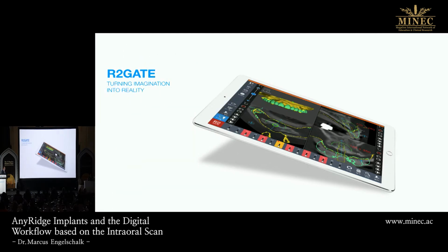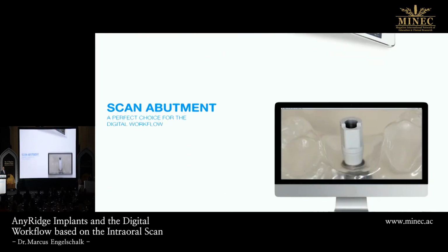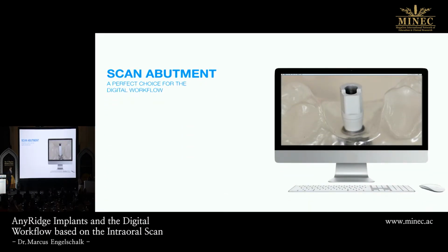So, R2 gate is the thing I don't want to talk about too much today, because we already heard a lot of it. This means we are planning right from the beginning. And trust me, it's not only for the full edentulous case. It's nice to have an R2 gate for 1 implant or 2 implants. It's easy to do. It reduces your time of surgery. But coming back to the intraoral scanner, to the scan bodies: this is something, a perfect choice for the digital workflow, I call it.